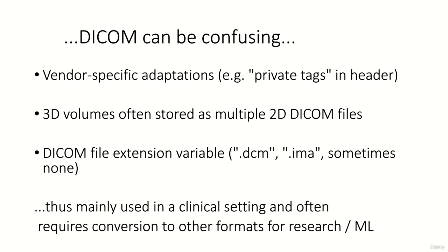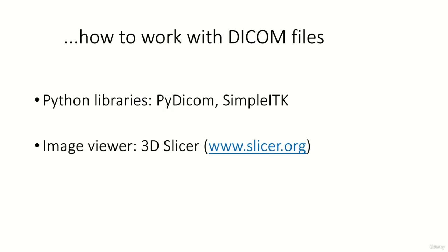Sometimes the file extensions might vary and you need to make sure that the files you are working with are actually DICOM files. All those points above are the reason that DICOMs are mainly used in a clinical setting, and to conduct research or to work with those files, we often convert them into other formats. But of course, those small problems do not keep us from working in the exciting field of medical imaging. There are great Python libraries such as PyDICOM and SimpleITK, which allow us to easily handle DICOM files in Python.